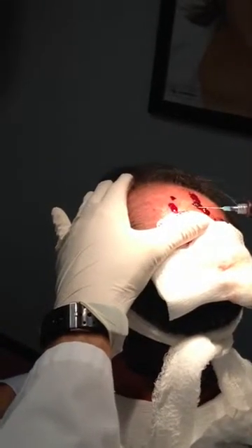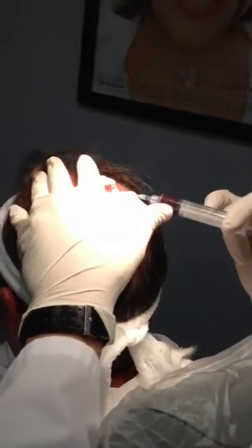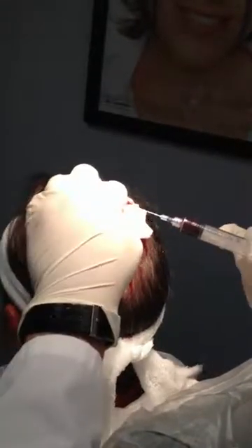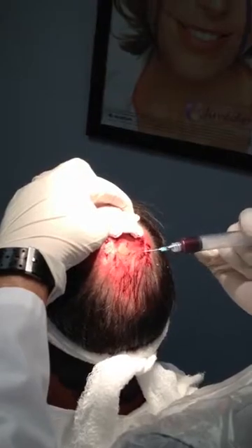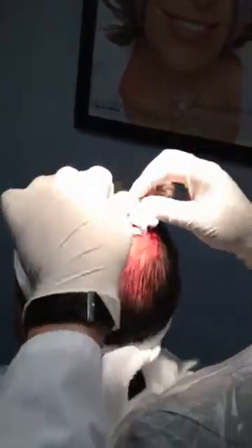Do you feel me here? Just a little pressure. Tolerable? Yeah. I felt better on the left side. We'll go back — sometimes you need a little more anesthesia. How about over here? That's okay. And basically that's all it takes to inject the cells right into the skin. The patient hardly feels anything. And that's basically all.